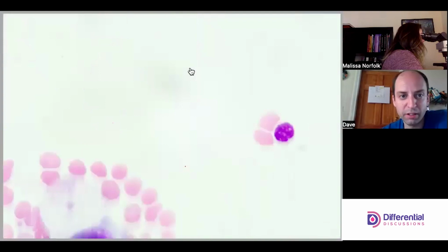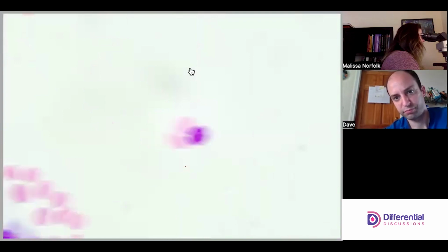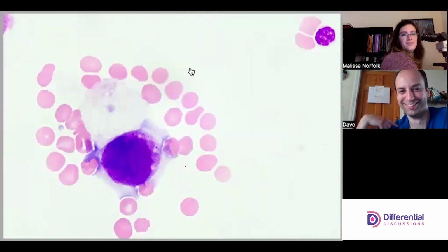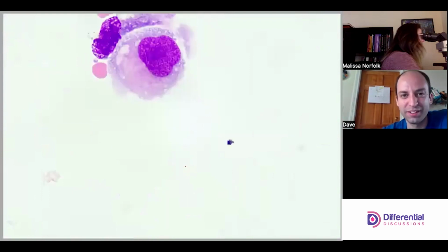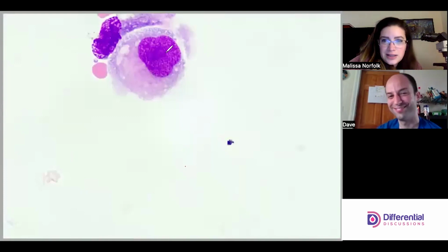Meh. I mean this one right here, right? Maybe a lymph there. This little lymphy guy. Let me try this. Yeah, that ain't good. The darkness of the nucleus, the shape. Oh, look at this one. Look at this nucleoli. It's like, let me get my little drawing dude out. It's literally like this.